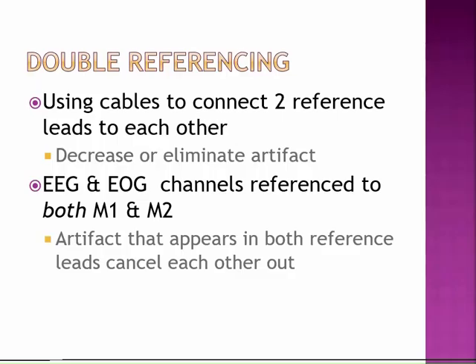So we'll do C3, M2. You have C3 placed over the area of the brain where we want to record electrical activity. Your M is recording the ambient electrical activity in the room. They both come together, and the like signals get cleaned out or washed out, because the like signals between those two electrodes, when you compare them, are all the ambient electrical activity that we don't want to record. That's the process of common mode rejection.